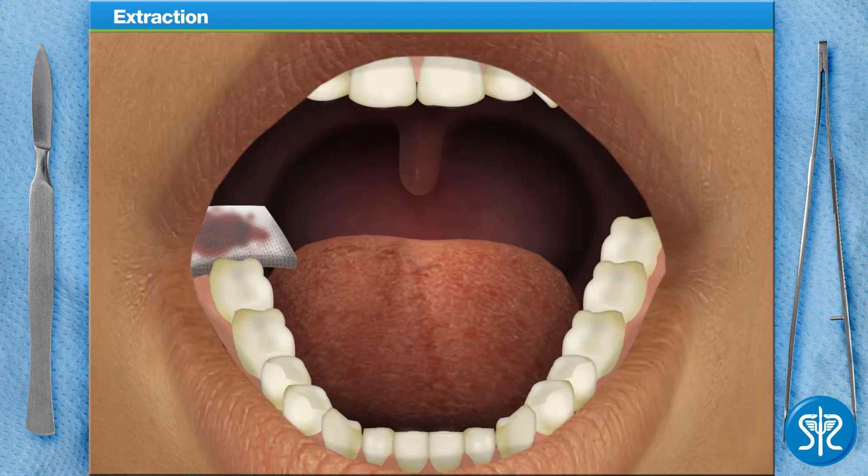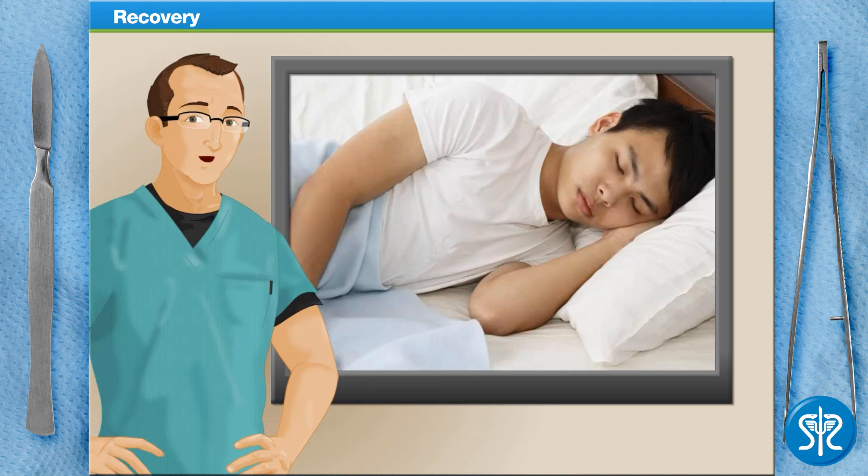Since the patient is clotting properly, we can go ahead and place some fresh gauze in their mouth. When getting wisdom teeth removed, it's important to remember that everyone recovers at different speeds. The rate of your recovery depends on a number of factors, including the complexity of the extraction, your age, and your individual recovery capacity.